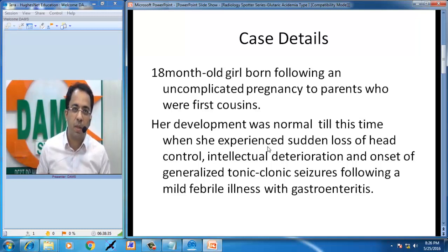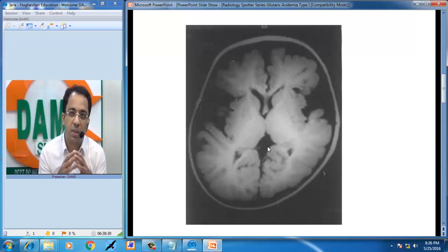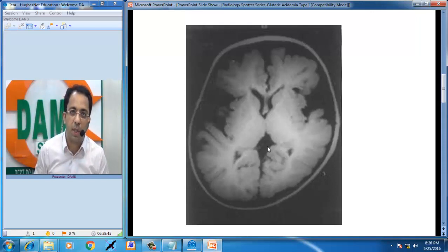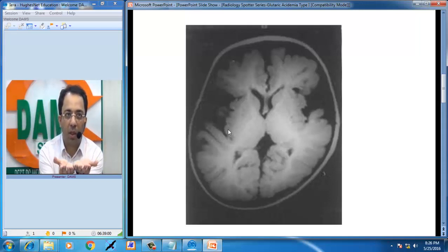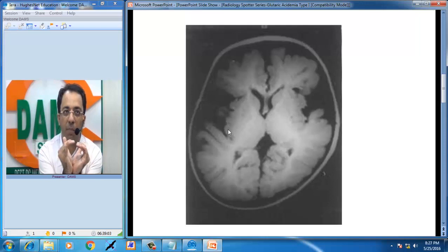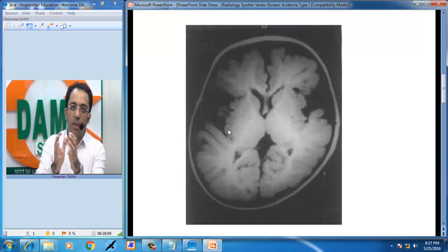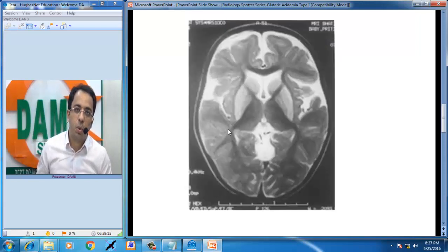We are looking at something like an inborn error of metabolism — we have consanguineous marriage in the history. As a radiologist when I see this T1-weighted MRI image of the brain, the outstanding finding is: this is the area of the frontal lobe, this is the area of the Sylvian fissure, and this is the area of the insular cortex. Normally the insular cortex and Sylvian fissure would have an operculated appearance, but in this patient the Sylvian fissures are wide open and there is lack of opercularization of the insular cortex.